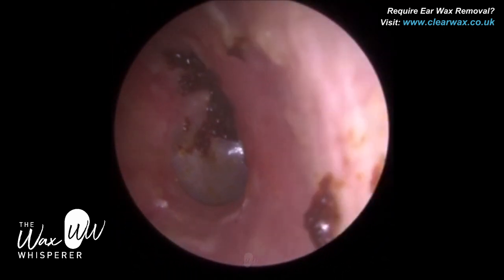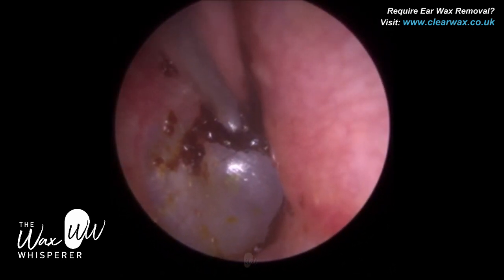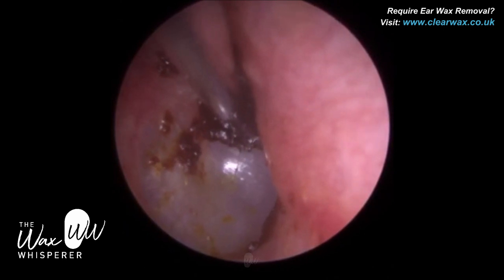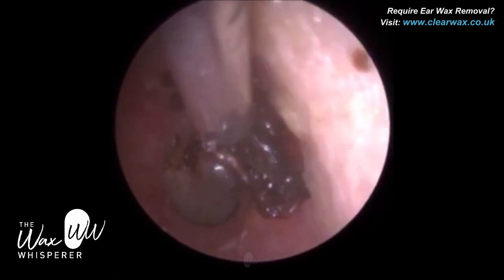We can see three quarters of the eardrum — the tympanic membrane. There's a bit of wax still impacted on the superior anterior quadrant, i.e. north-east if you're looking at a compass.